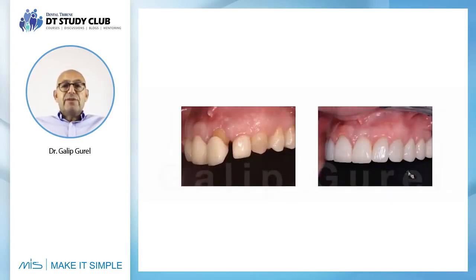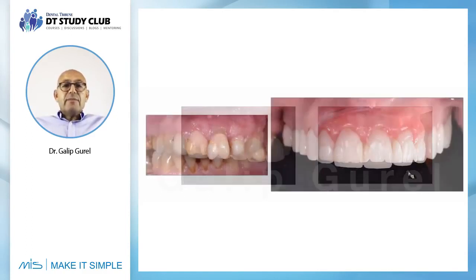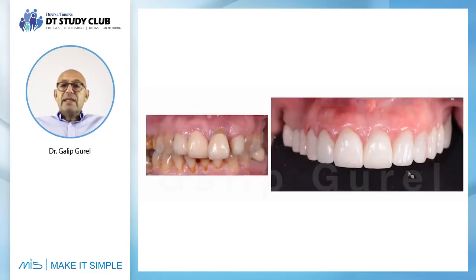So this was before on the left. This is how nicely the implant and veneers are positioned in place. This is from the other side. Look how protruded the left central was, and now how beautifully not only the buccolingual version but also mesiodistal soft tissue, the vertical soft tissues were aligned, and this is from the facial, the beginning and the after.